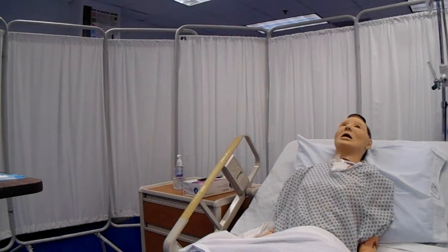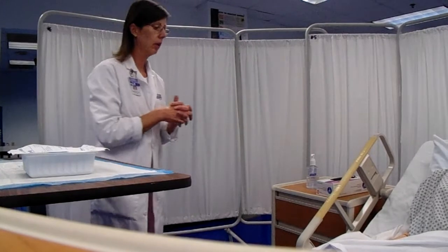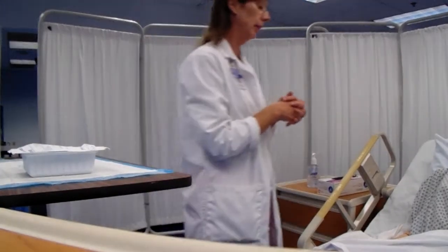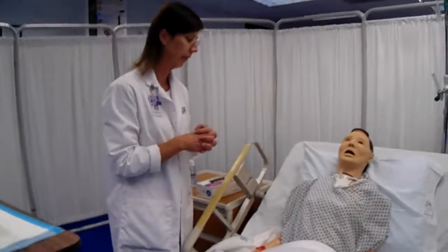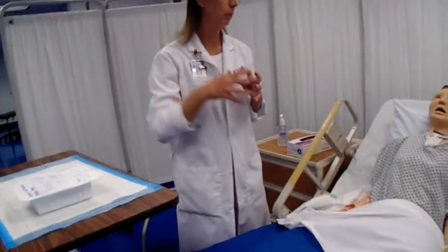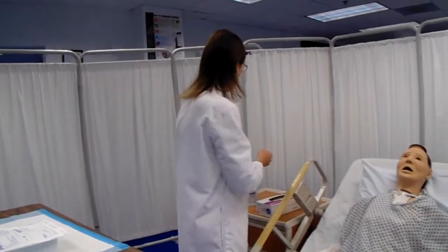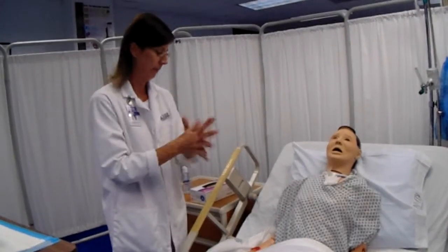Knock, knock, knock. Good morning. My name is Margaret. I'm a nurse for Kaiser University, and I'm here to check your central line and the dressing. I have washed my hands at the sink and provided for privacy. I will now perform hand hygiene at the bedside.